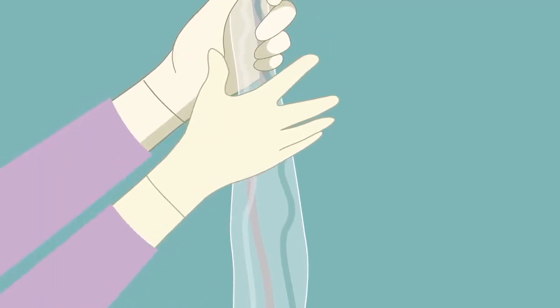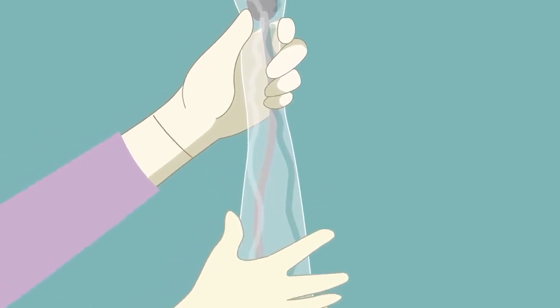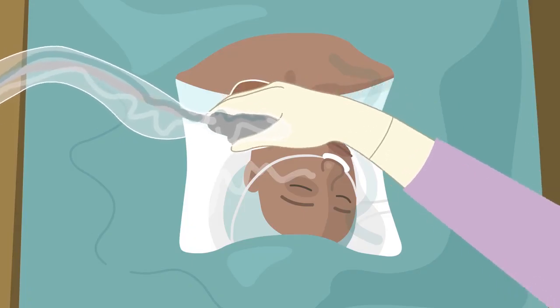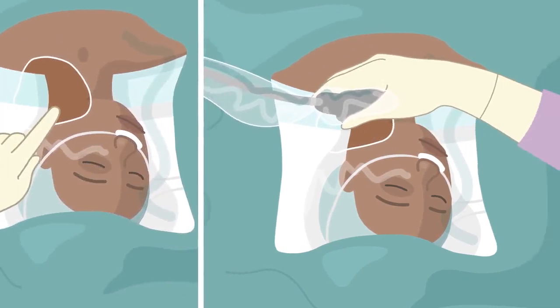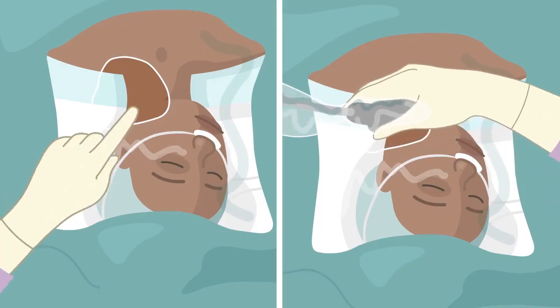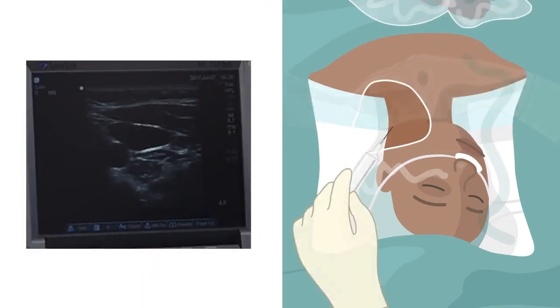The physician prepares the ultrasound using an aseptic technique and attaches the system to the sterile drape. The physician once again locates the anatomical structures by ultrasound or landmark technique and applies local anaesthetic. All catheter lumens are flushed with sterile saline. Using ultrasound or referring to the marked site by landmark technique, the physician punctures the vein.